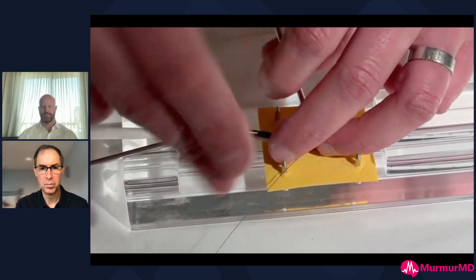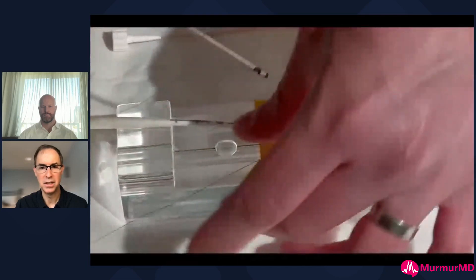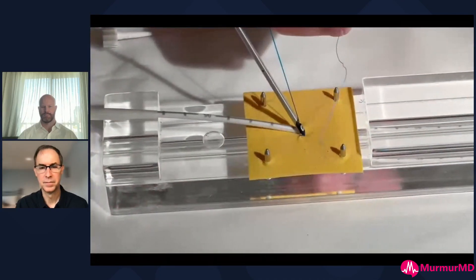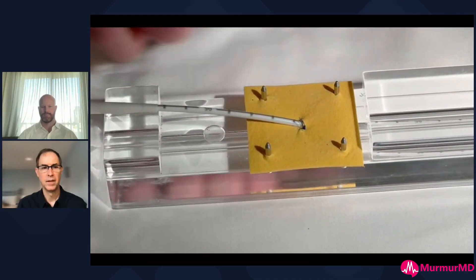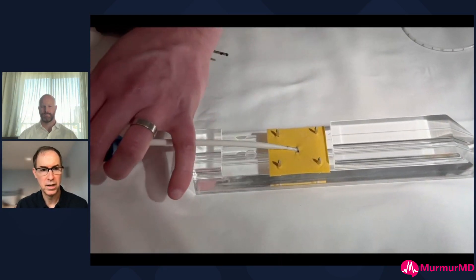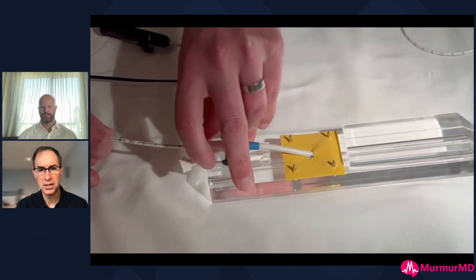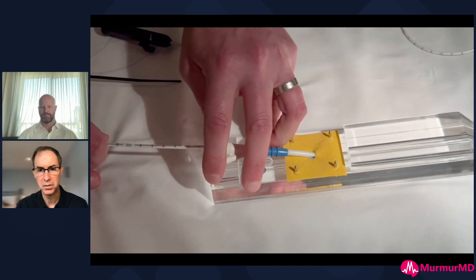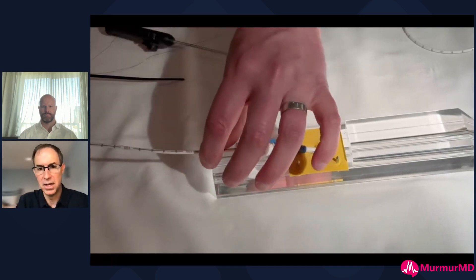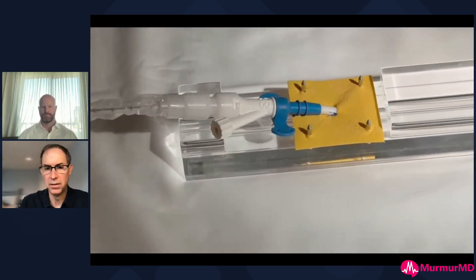You pull down and tighten the knot. Once the knot's tightened, you remove the sheath, lock it, and cut it. Now you're all set to re-advance the repositioning sheath. Somebody's still holding pressure over the groin while you control the shaft of the Impella so it doesn't move forward or backwards. There's a little bit of tension going in but really not a whole lot - it should go relatively smoothly. You can see on the model how snug that hole is around the repositioning sheath. Then you reintroduce the protective sleeve and lock it.